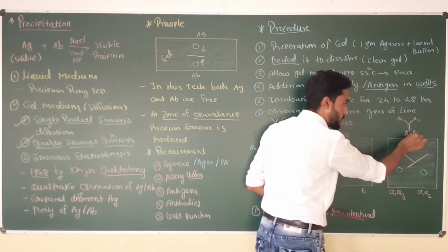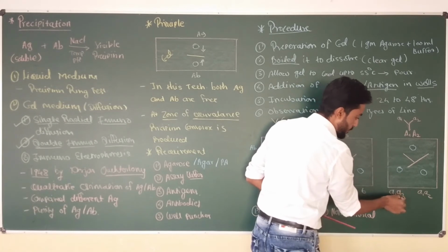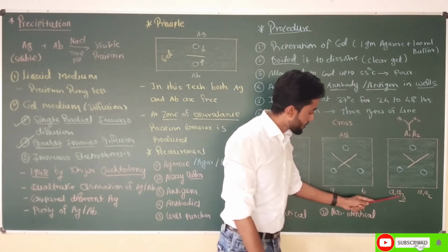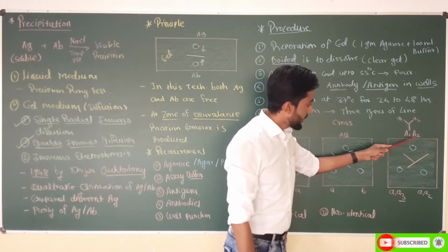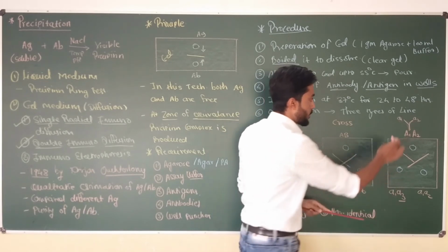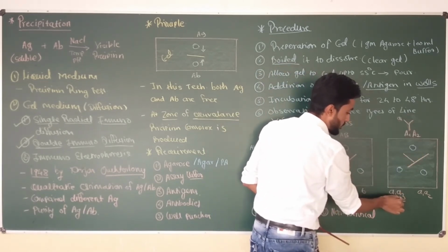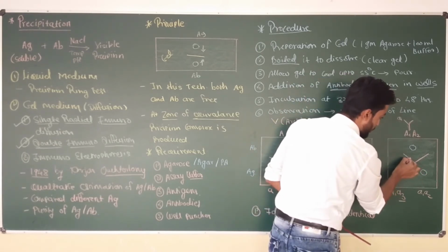But now this A2 portion of the antibody does not have a binding site on the antigen, because this antigen contains the A3 type of epitope. This A3 epitope is non-specific for the A2 binding site of the antibody, so this A2 binding site of the antibody remains free and will not bind to A3, so this second line will remain short.